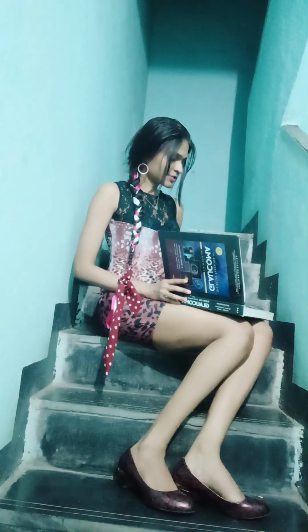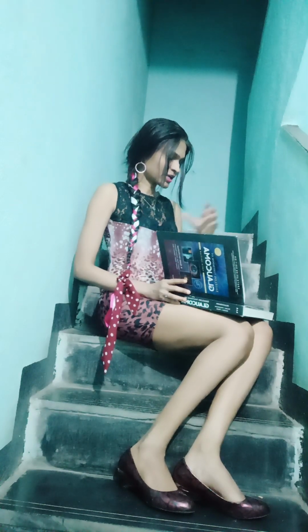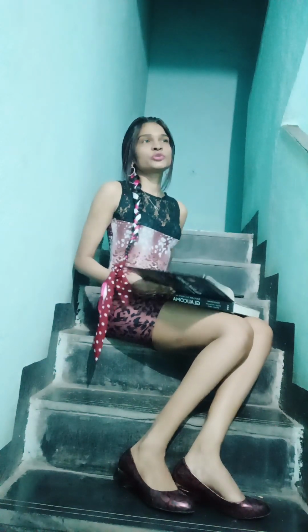After that, the examiner holds the gonioscope in one hand and the light source in the other hand. With a separate illuminating system and gonioscope, the examiner has to use both hands to hold the illuminator and the lens to examine the patient's eye.